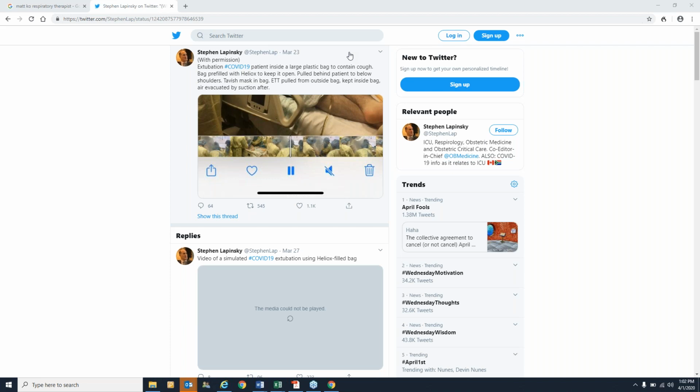So going forward, that's what we will be employing, just to ensure that there is no rain out. We did notice that there's a fair bit of rain out because the expiratory filters aren't heated. So we did elect to retrofit them. And hopefully that just reduces the circuit breaks every 48 hours in terms of replacing the mechanical filters at the expiratory end. And we're still doing heated humidity, just because with the HMEs, I know they have to be changed regularly. I don't know if it's Q12 or Q24 plus PRN. So again, we have purchased a number of HMEs, but we're still electing to do heated humidity as long as we still have the supplies for it, just because it negates breaking the circuit more often.